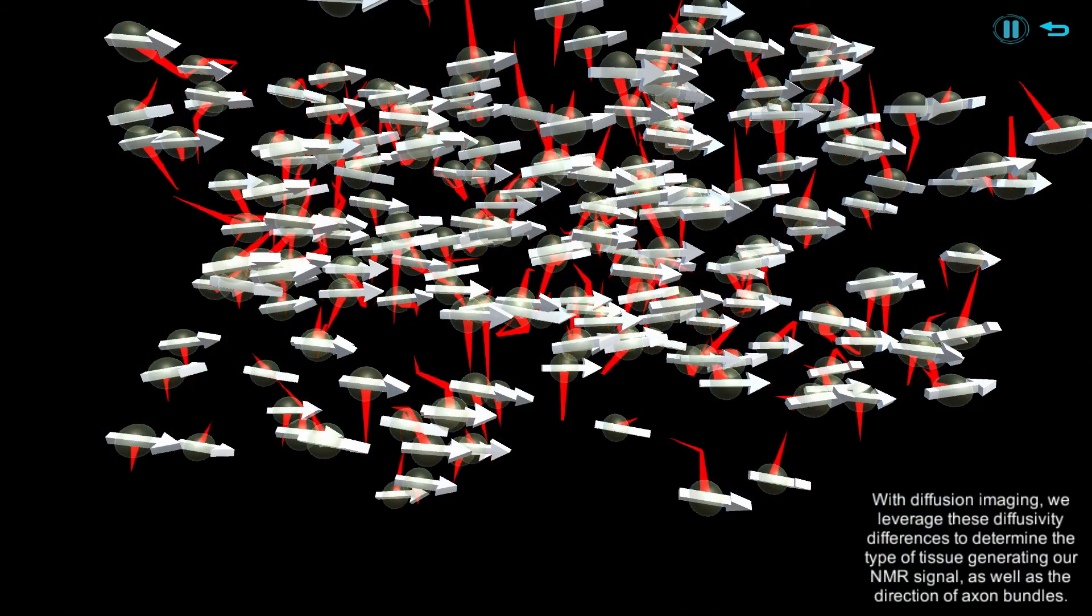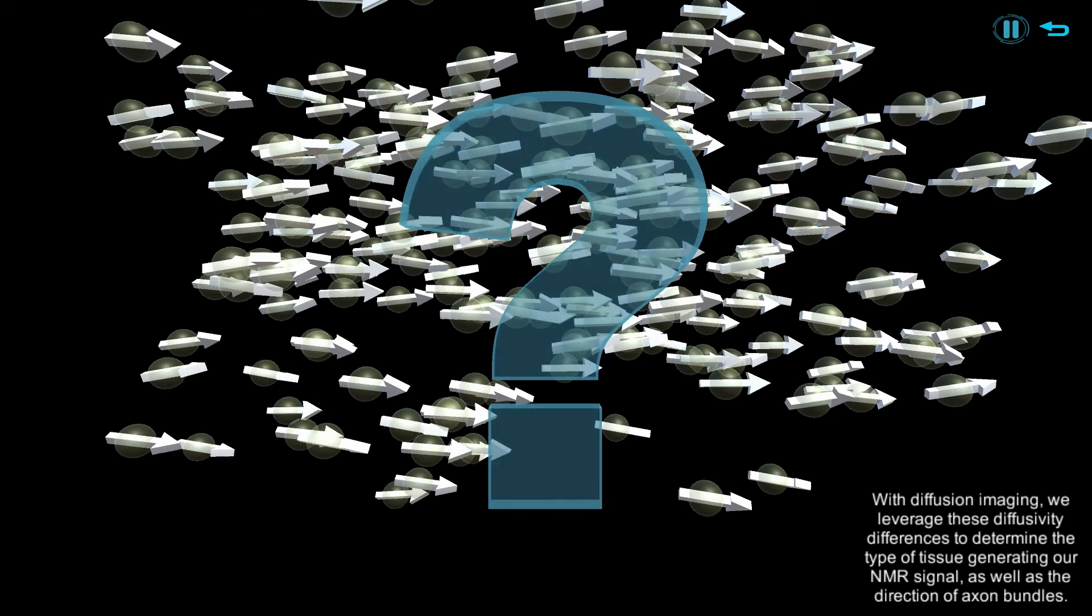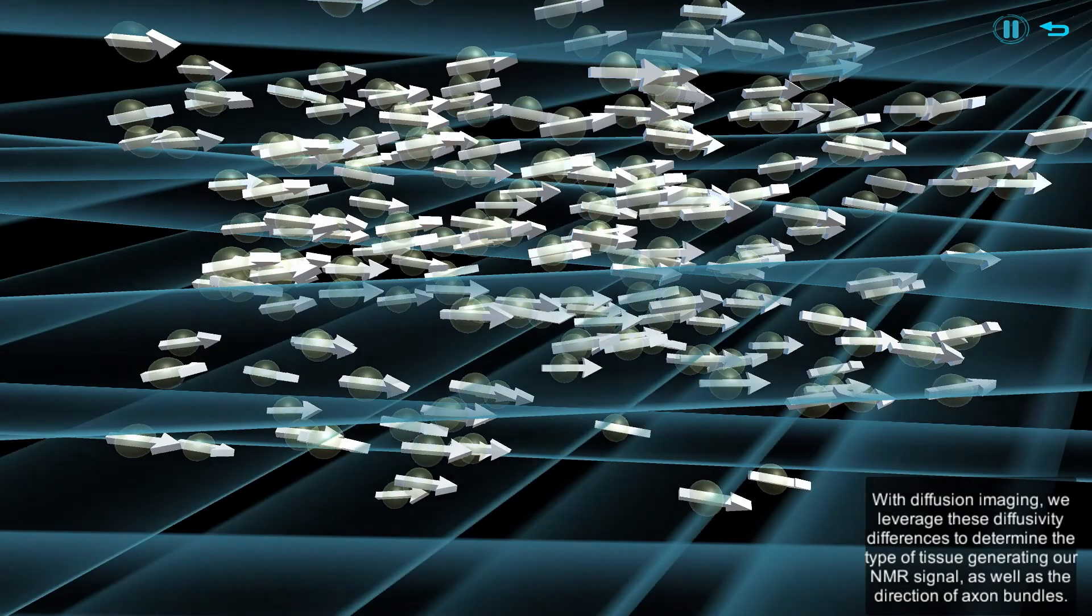With diffusion imaging, we leverage these diffusivity differences to determine the type of tissue generating our NMR signal, as well as the direction of axon bundles.